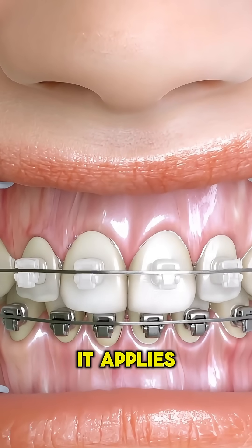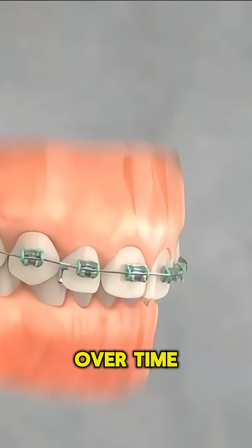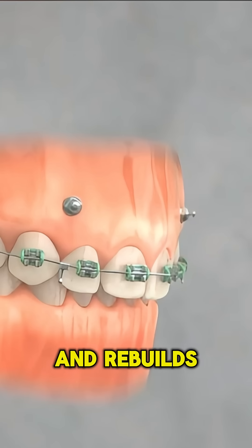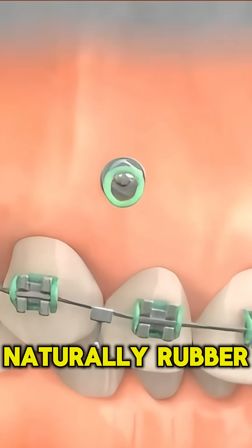When the wire is tightened, it applies controlled force, guiding the teeth to move through the bone over time. The bone around each tooth breaks down slightly on one side and rebuilds on the other, allowing the tooth to slide into its new place naturally.